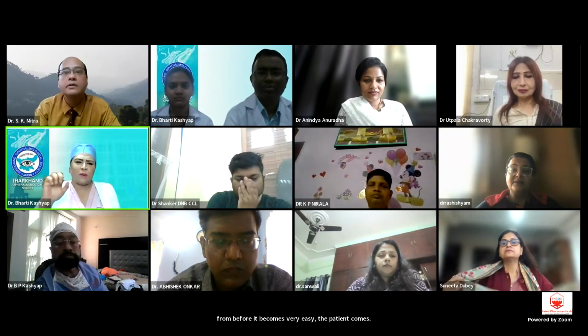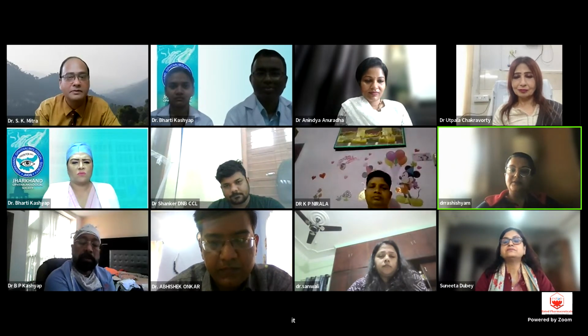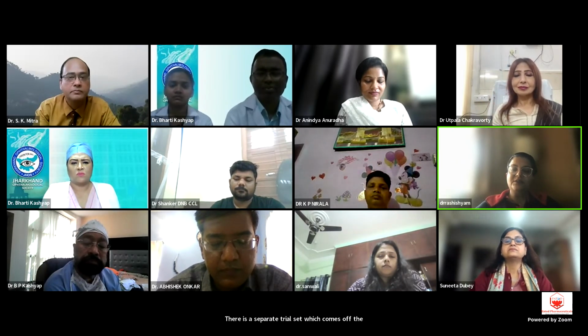Where do we get these rimless glasses? It comes in the trial set. There is a separate trial set which comes with the machine. It has a wire rim, a round lens mounted on it with a small holder.